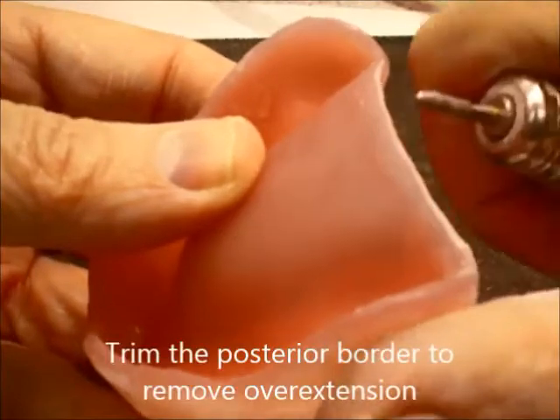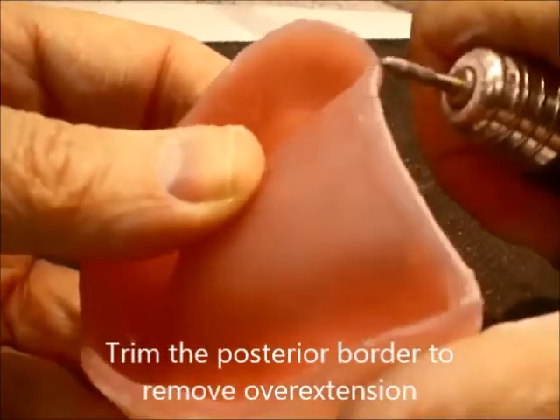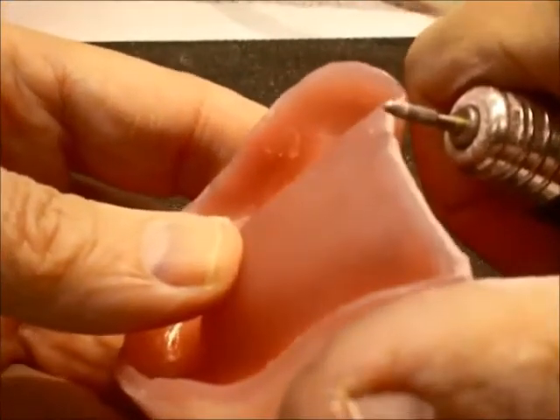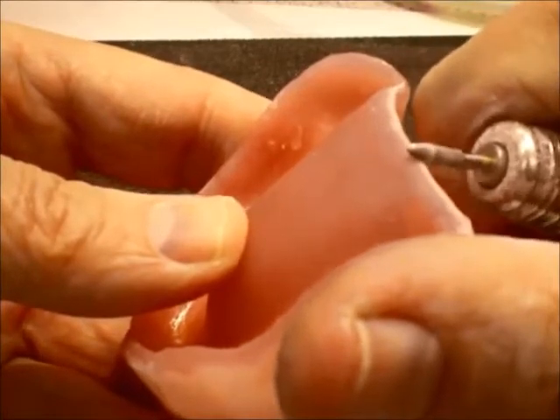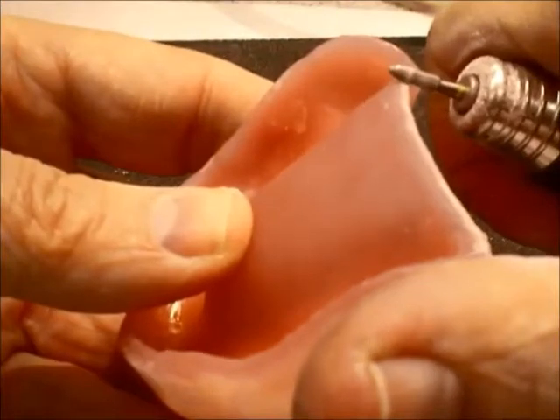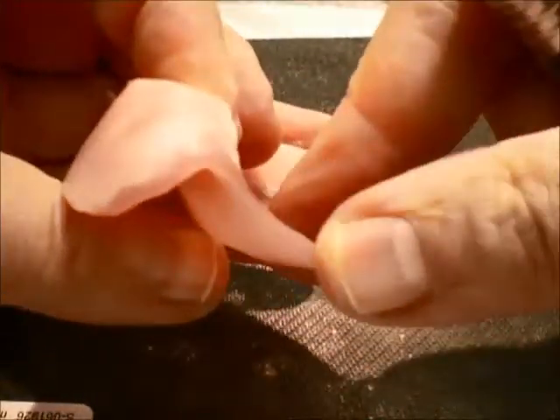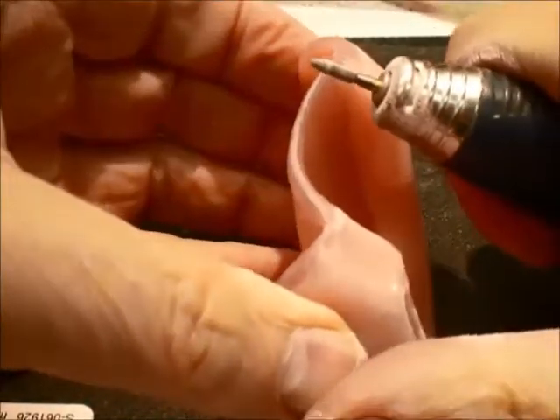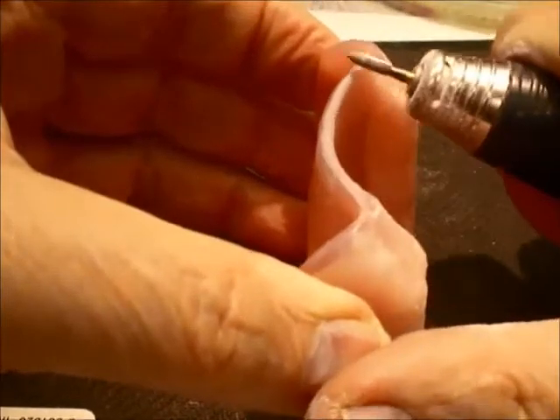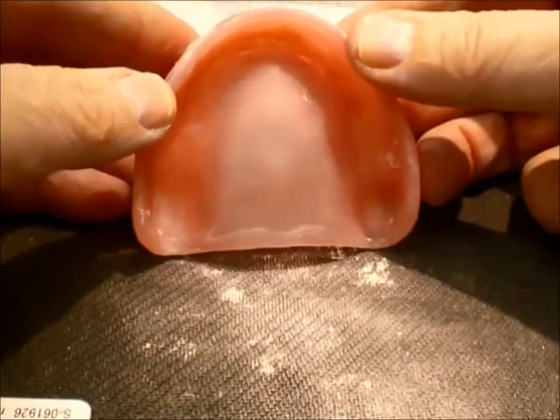When you do the try-in, you can evaluate the extension of the posterior palatal seal area in the mouth. It is important to note that acrylic can be added if you feel this area is inadequate, and it can also be removed. Here the acrylic is being trimmed — this is light-cured acrylic base — and the posterior base is smoothened and rounded so as not to interfere with the tongue.